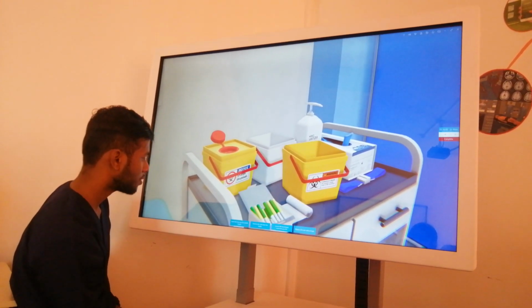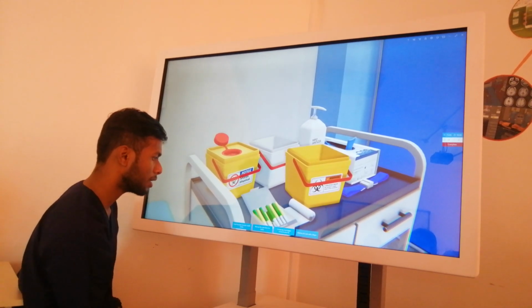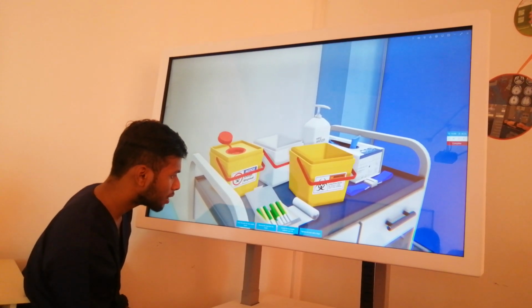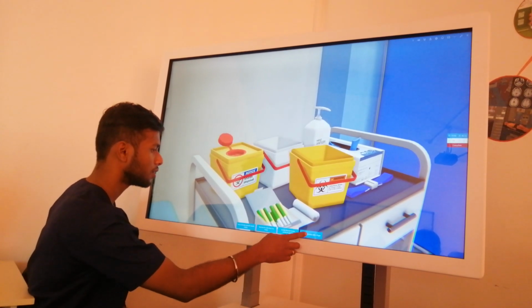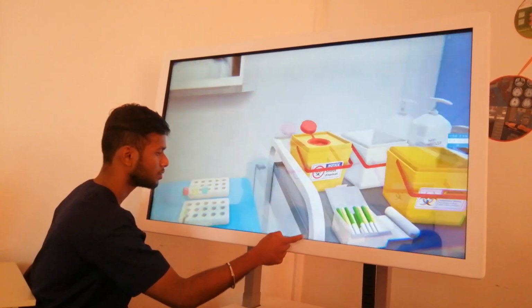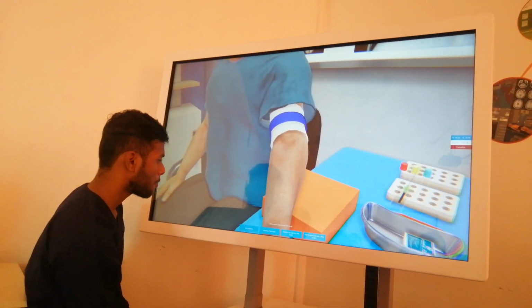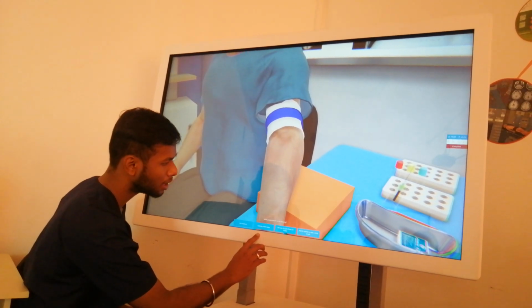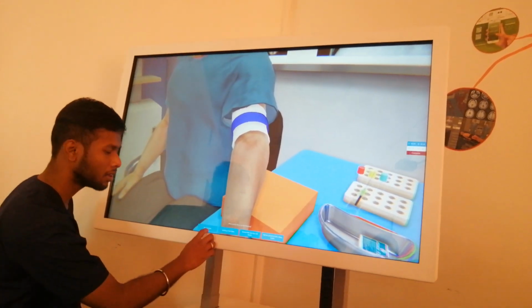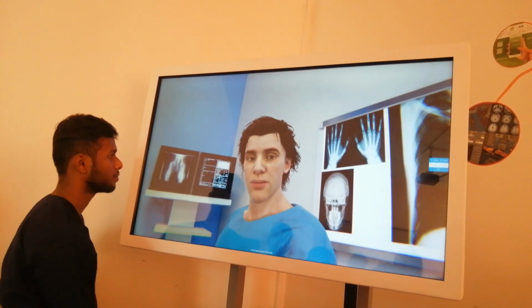What process should be the following? Insert the tube into the needle holder, remove the tube from the holder. Loosen the tourniquet, unclench your fist, fixation of vein with the fingers. Fixation. Fix the vein by pulling on the patient's skin. What process should be the following? Vein puncturing, labeling of test tubes, remove the tube from the holder. Ask the patient to take a deep breath.